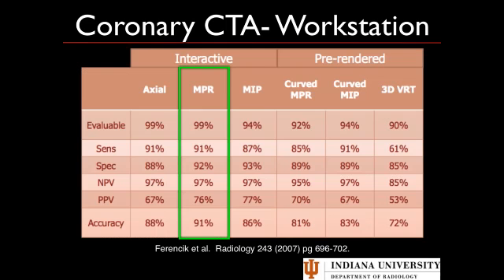There's at least one study that was published in Radiology in 2007 looking at what is the most accurate way to interpret these studies, and you'll notice that the best way that they came up with was interactive MPR versus pre-rendered images by your technologist.